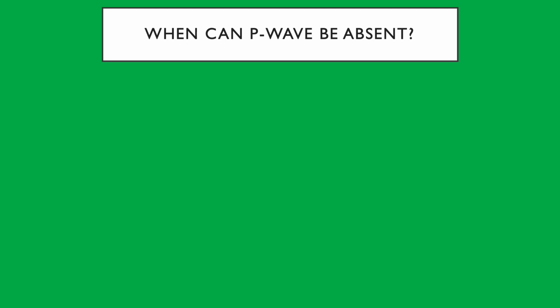Can the P wave be absent, and if yes, when? Flutter, fibrillation. Atrial fibrillation. Okay. What else? It could be hidden in the QRS complex, or followed by the pacemaker. Blocks. Wait, wouldn't there be a presence of the P wave because of a block? An AV block usually has P waves. It could be hidden inside the T, yes, but we will do it after.